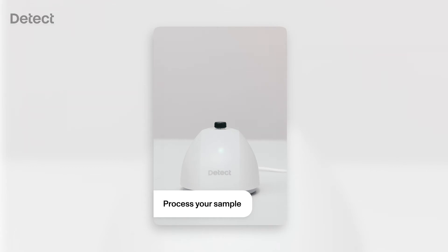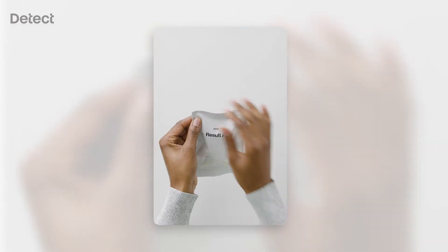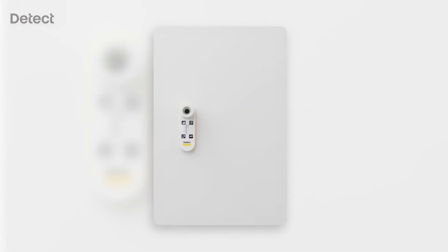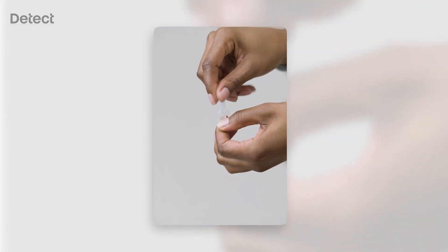When it's complete, the green light will stop blinking. Once your sample has processed, open the result pack. Take out the reader and remove the dropper from its pouch. Pick up the dropper by its tip and flick it downward to collect all of the liquid at the bottom. Carefully twist off the tip.